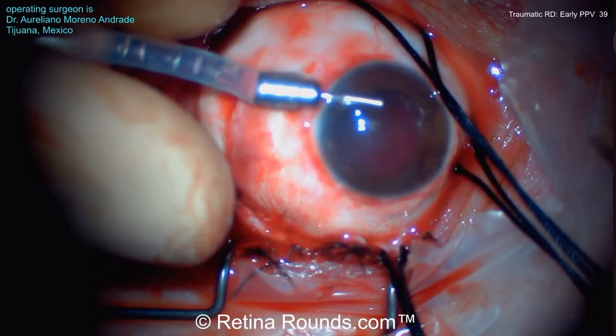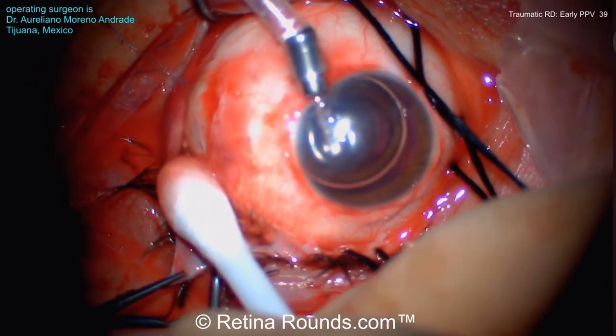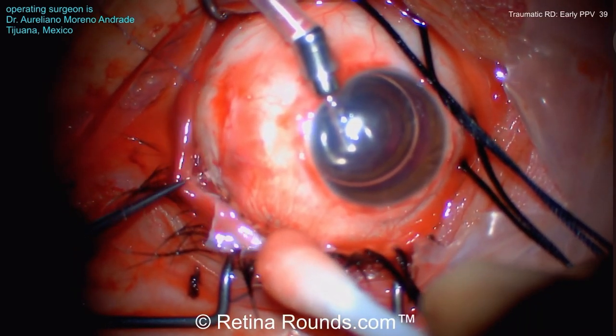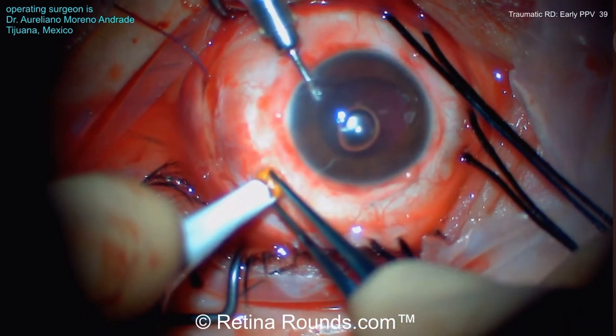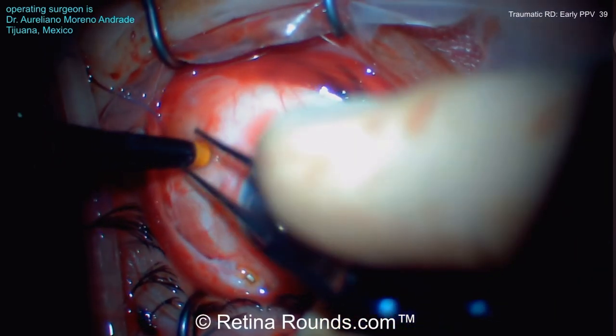Now he's switching over to performing the vitrectomy, and you can see that there's a 6mm infusion cannula that's been placed in the anterior chamber. And I think the reason that he's chosen to place that infusion line in the anterior chamber is to pressurize the globe. He's then checking the rupture site to make sure that it's watertight.